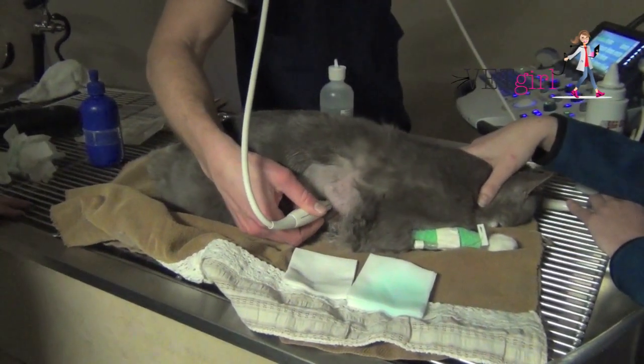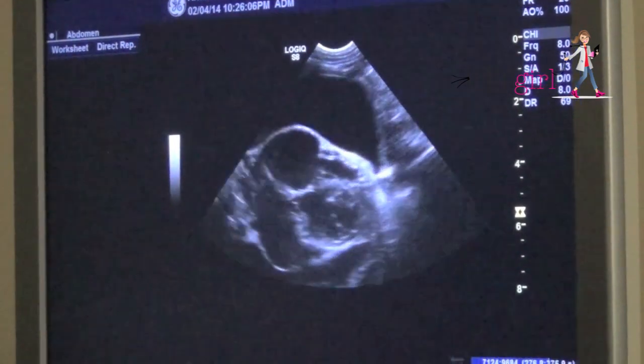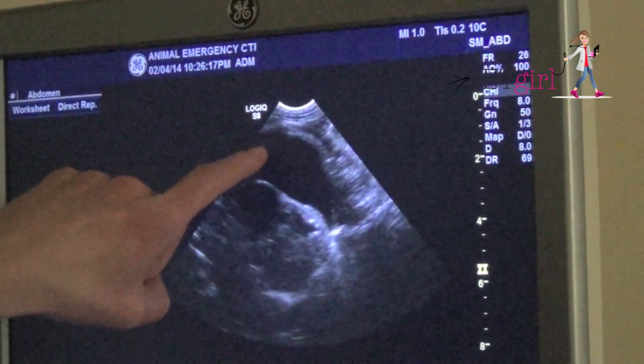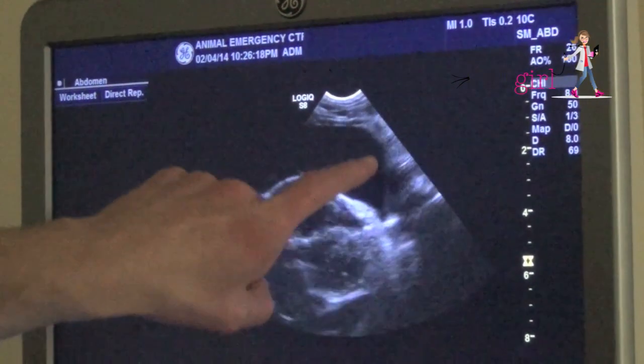If you have an ultrasound, we want you to be able to do a FAST ultrasound to look for the presence of a large black hypoechoic pocket. Here, you can see we're using the FAST ultrasound to identify the best location.